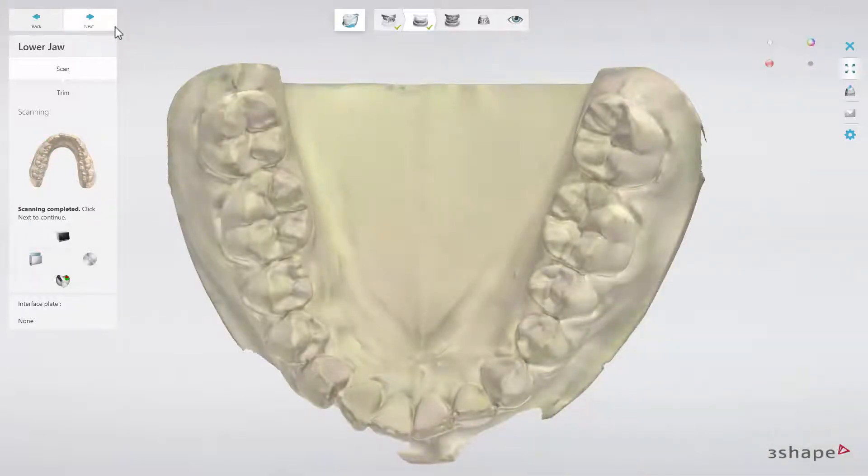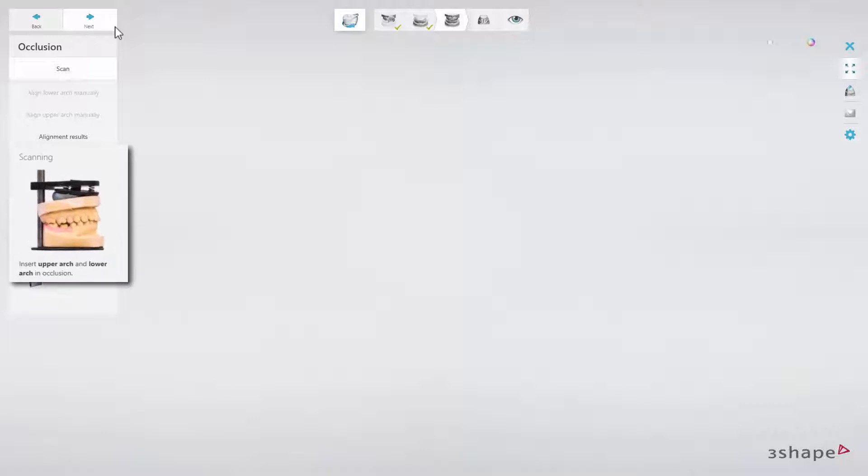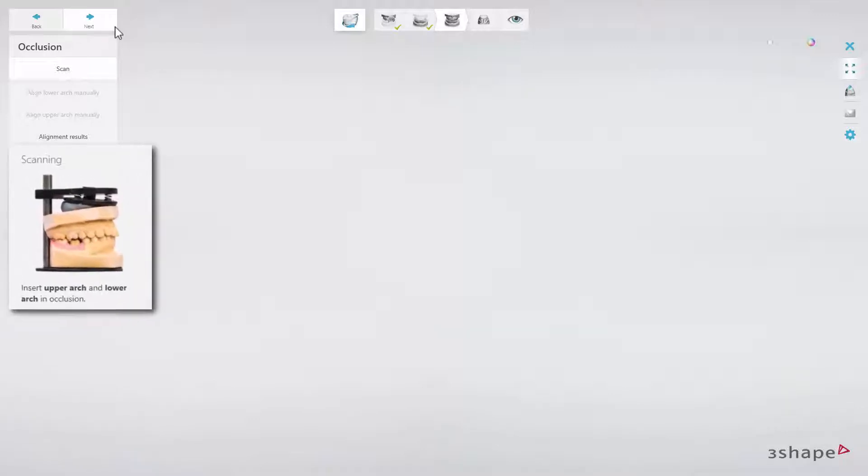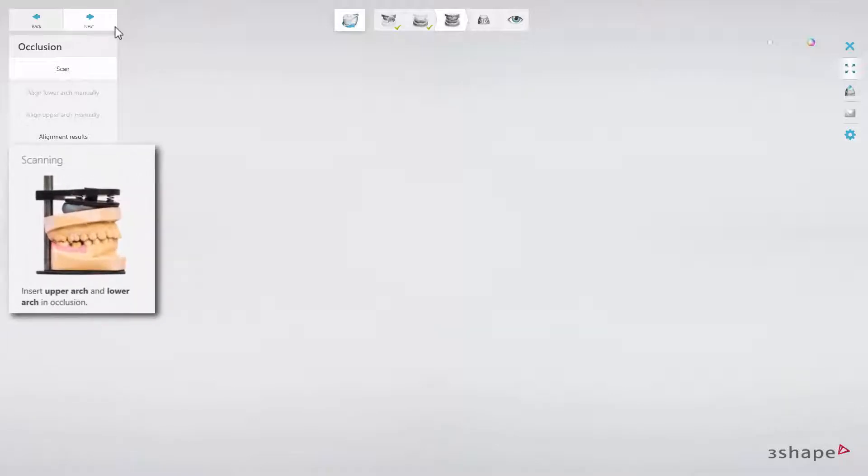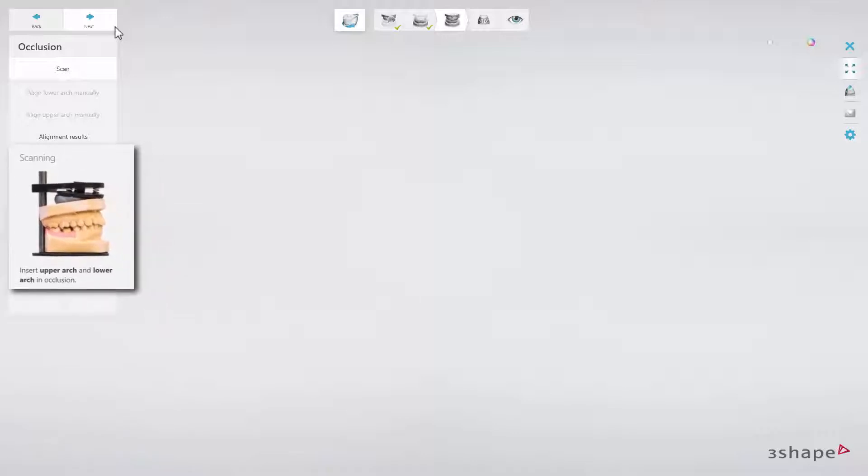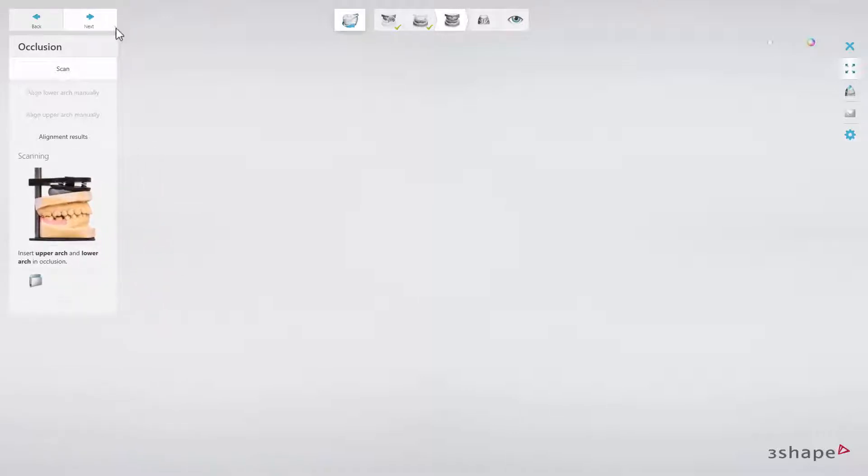When done, click Next to scan the occlusion. The software will ask you to put both arches into the scanner in order to scan the occlusion, however scanning the bite using an Articulator requires changing the settings.